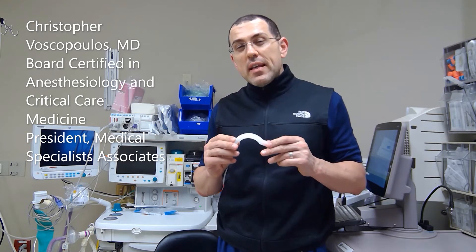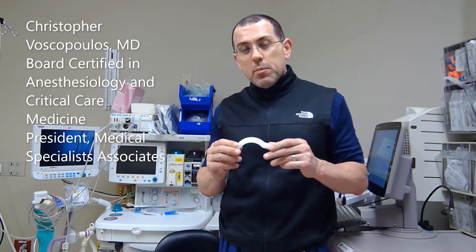Welcome to another segment in our airway series, this one on how to place an oral airway. This is part one of two in this particular module. In this segment, I go over how to place an airway with the use of some anatomic backdrops where I can emphasize the anatomy upon its placement. In part two, I review how to place the oral airway in a live demonstration.